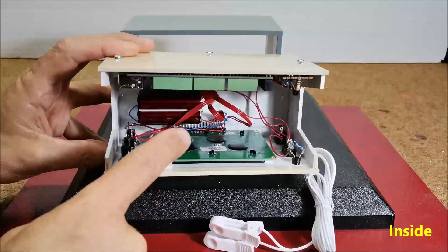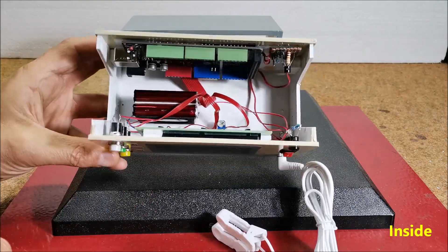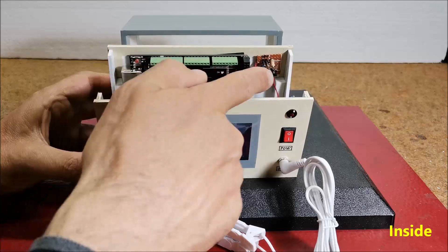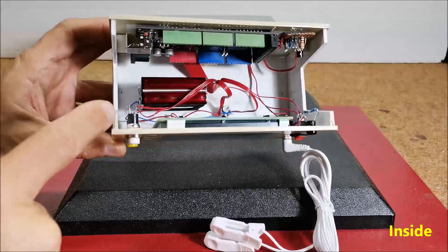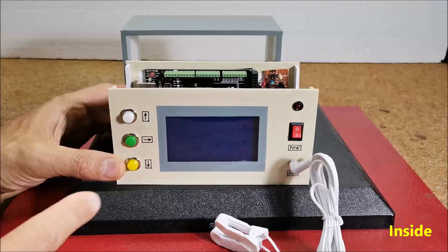Next, an ST7920 chip-based LCD with 128 by 64 dots resolution. A BC337 NPN transistor. Two resistors. A trimming potentiometer of 10 kiloohms. And three buttons.